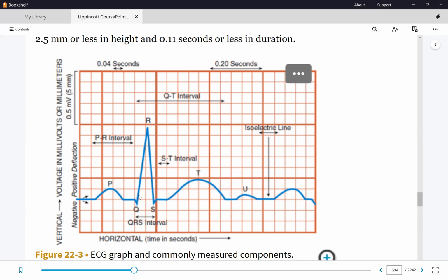It would be somewhere here. Because the atrial voltage is so small when contracting, how much smaller will the repolarization be? It's probably somewhere here, we just don't see it. But of course, when we see another P wave, we know that it had repolarized. We just don't see it because it's too small.